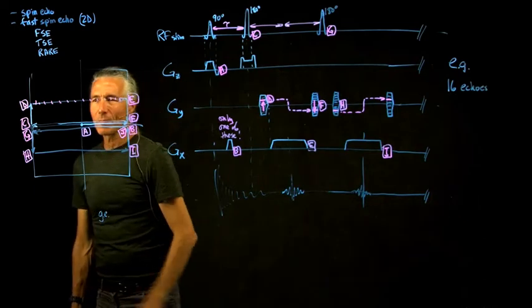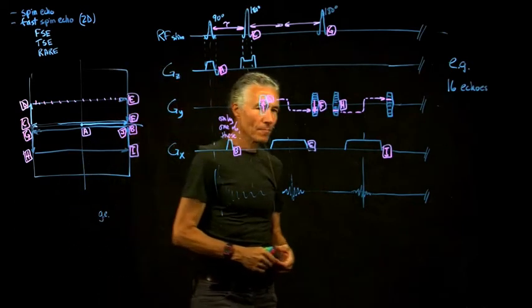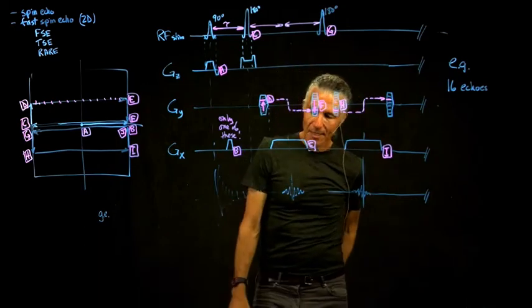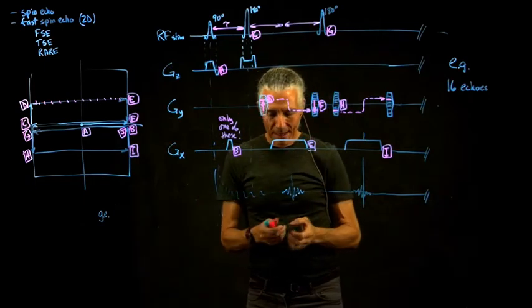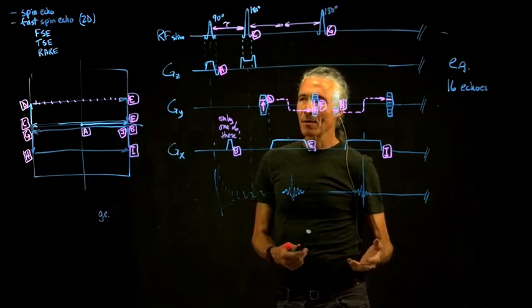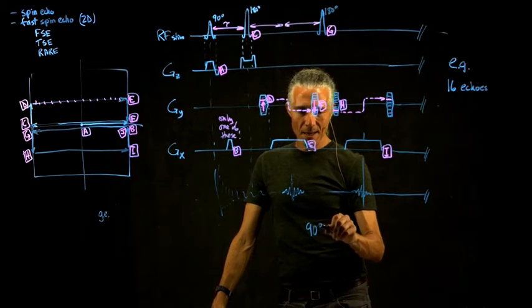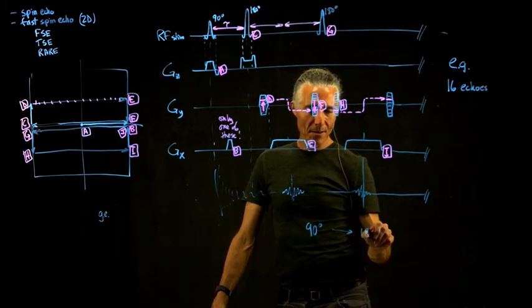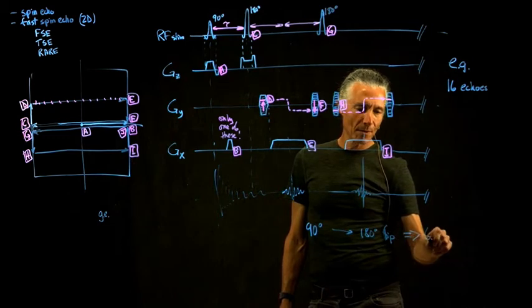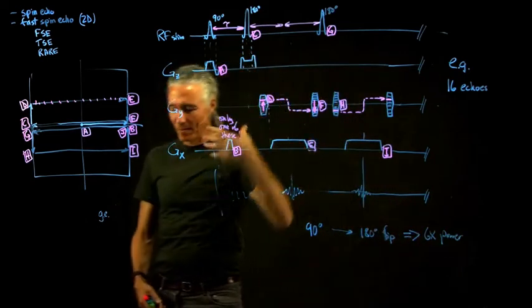So what's stopping you from doing more? You might think, why don't we do like 60 echoes or something like that? And what stops you from doing more is the 180s. The reason is because the 180s deposit a lot of power. We could write down the approximate equation for the deposition of power, but if you compare a 90 to a 180 degree flip, it's actually about 6 times the power. So it's 6 times as expensive to do a 180 in terms of heating up the subject.